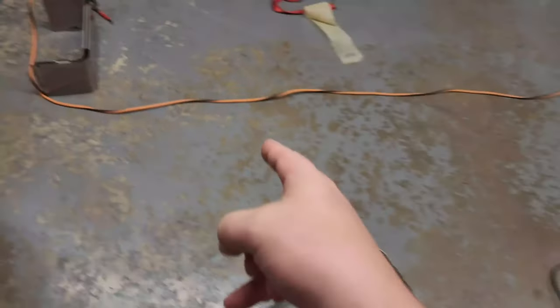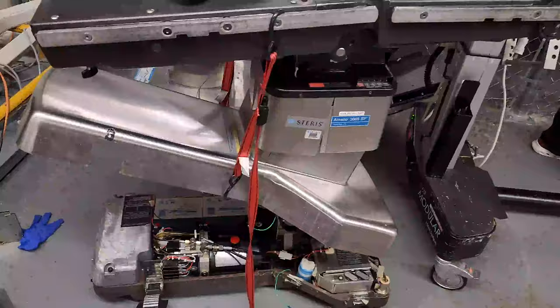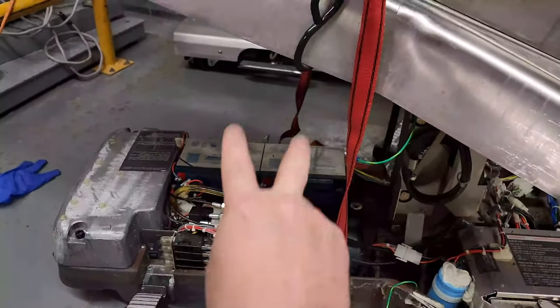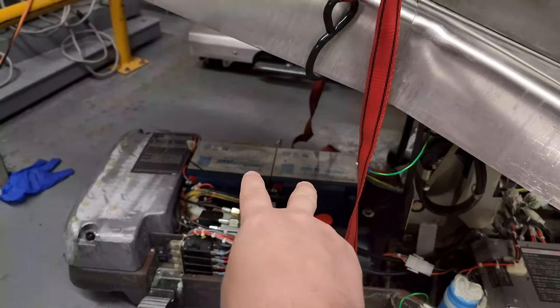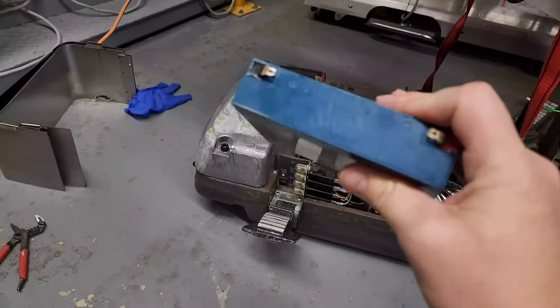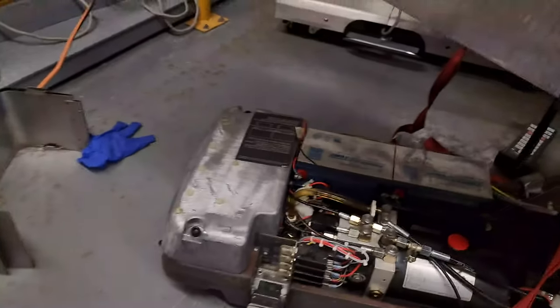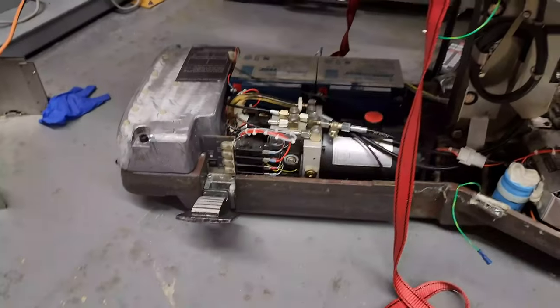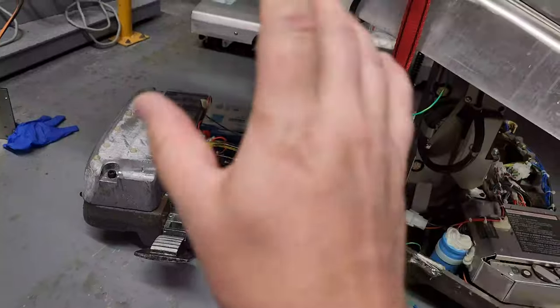We have another 3085 over here. This one has some newer 28 amp-hour or 26 amp-hour batteries, but the control batteries — you can see right there, dated 2014. The control batteries sit right next to those ones and they all have to be changed out at the exact same time. So we are changing out the batteries on this one and it should be good to go.